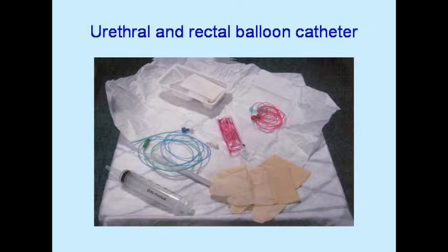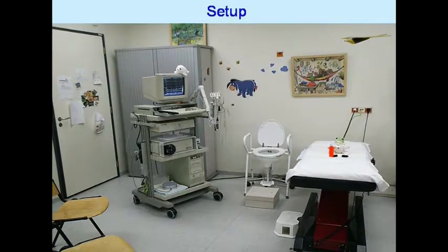Cystometry involves insertion of the rectal and bladder catheters, and this is not very pleasant for a child, and hence we have to make every effort to make the experience better or even pleasant for the child, and this involves having a very friendly environment and setup.